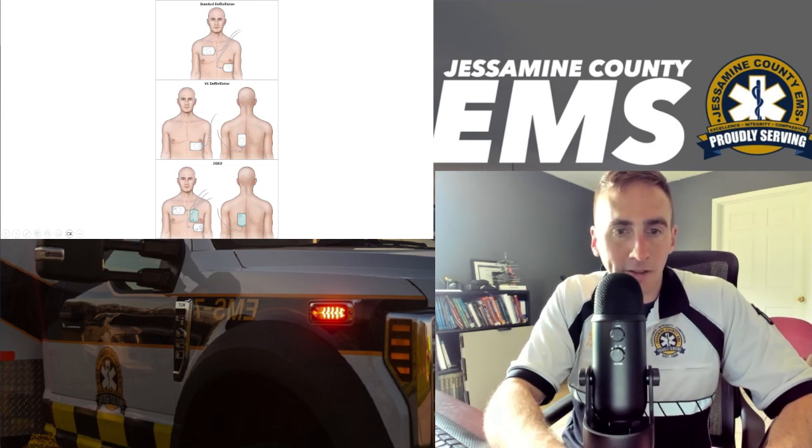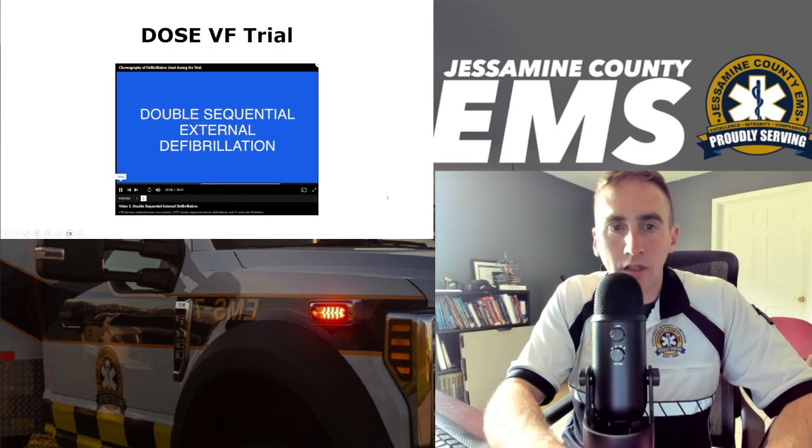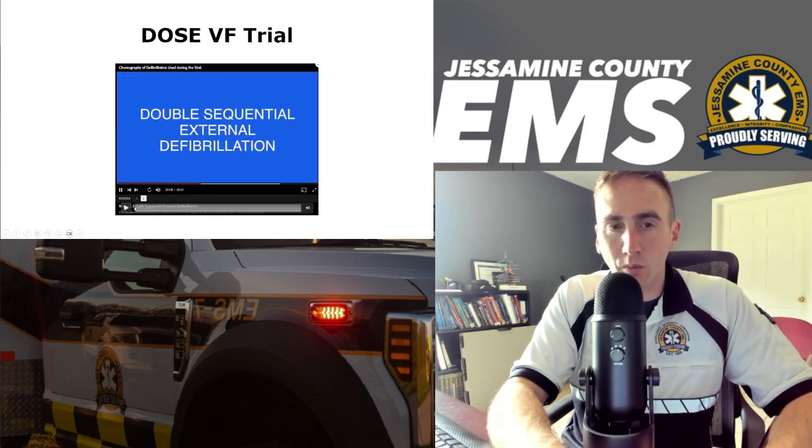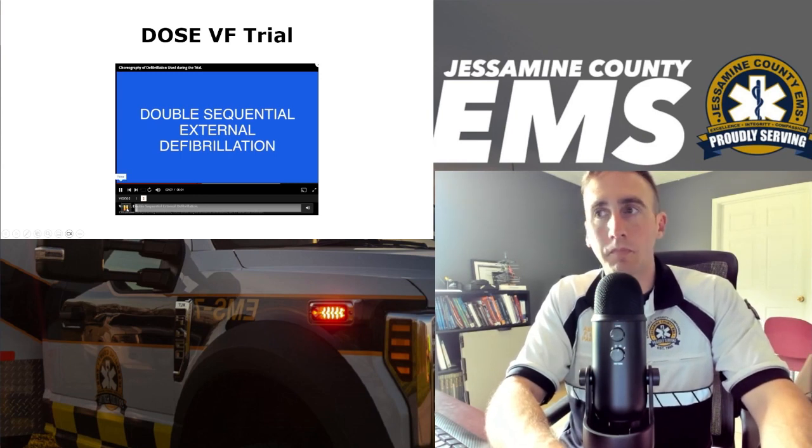First set of pads here, 1A, 1B. Second set of pads here, 2A, 2B. Okay? And I'm going to play this video of the study protocol and how they did it, and talk to you about how we do it might be different.